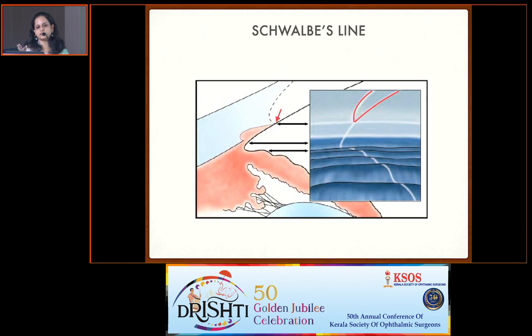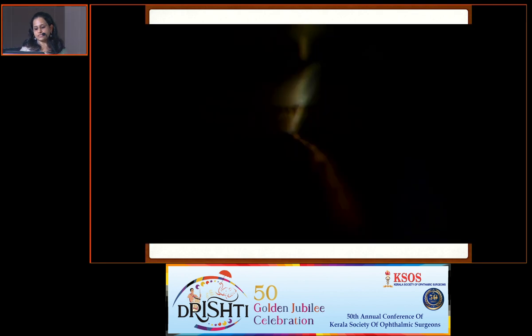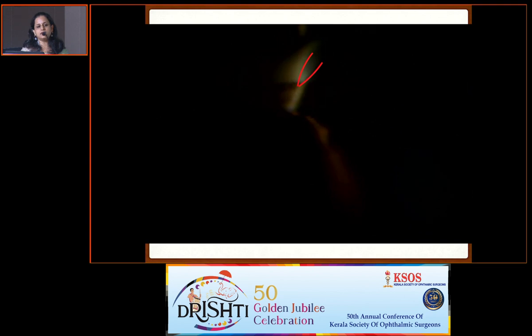Corneal wedge technique is nothing but you have to keep a small slit and keep it at an angle of 60 degree. You can see two lines which are coming from the anterior and the posterior surface of the cornea. These meet together at the Schwalbe's line. So this is an example of corneal wedge technique. You can see the anterior one and the posterior one joined together at that line. That is the corneal wedge which is corresponding to the Schwalbe's line.